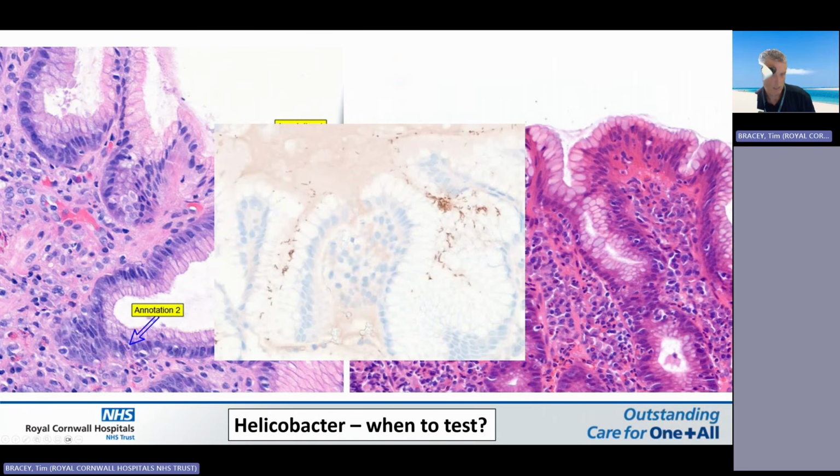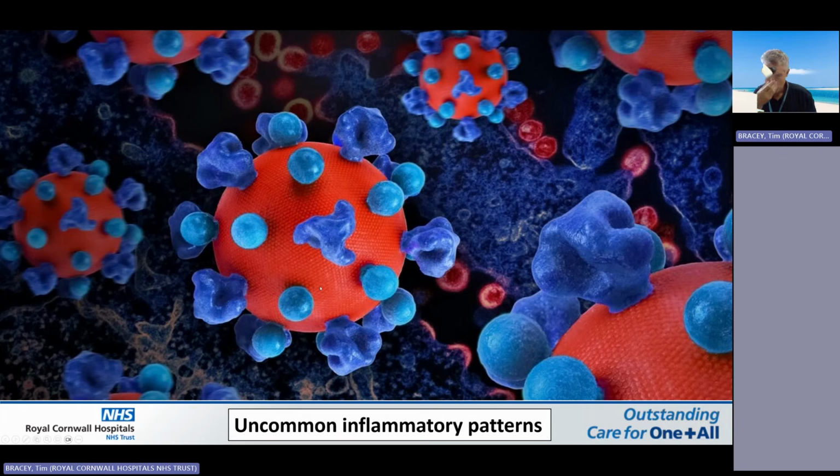And if you're lucky, you not only get the positive IHC, but you also can see the morphology of the bacteria as well. So moving on to slightly more uncommon inflammatory patterns.